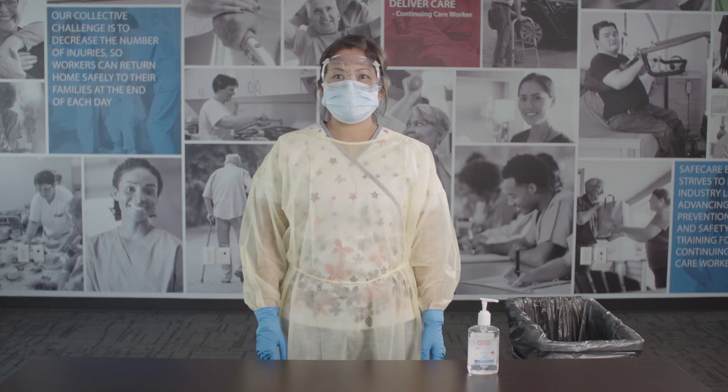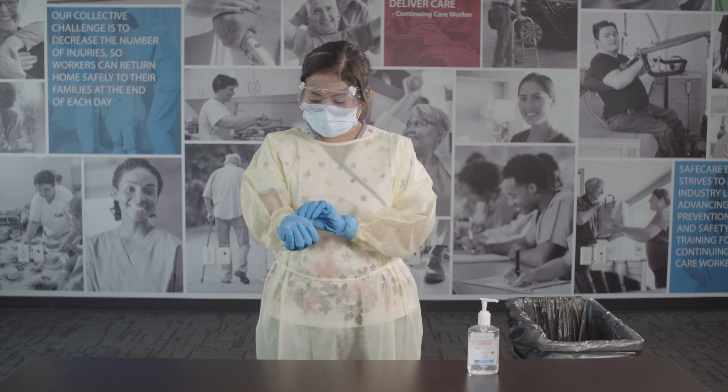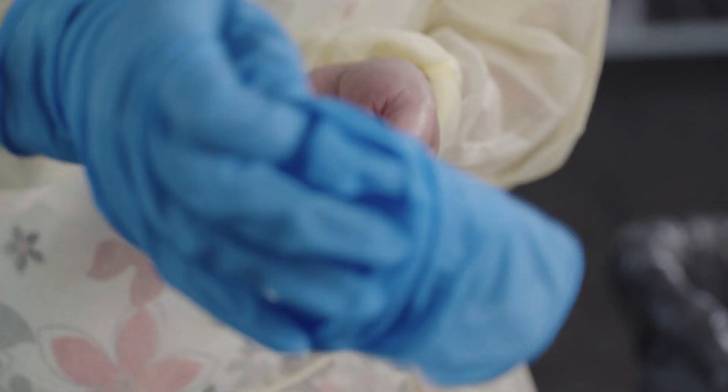When it is time to remove your PPE, begin with your gloves. Pull the sleeve of your gown slightly to expose the clean part of your cuff. Grasp the palm area of the glove on your other hand and peel it off.